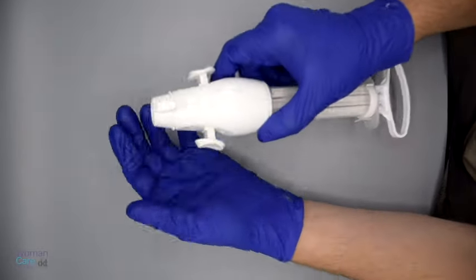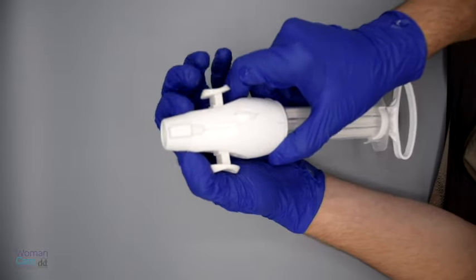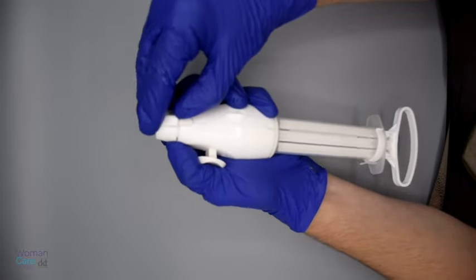Remove the valve cap by pressing down on the tabs of each side with one hand and removing the cap with the other hand.